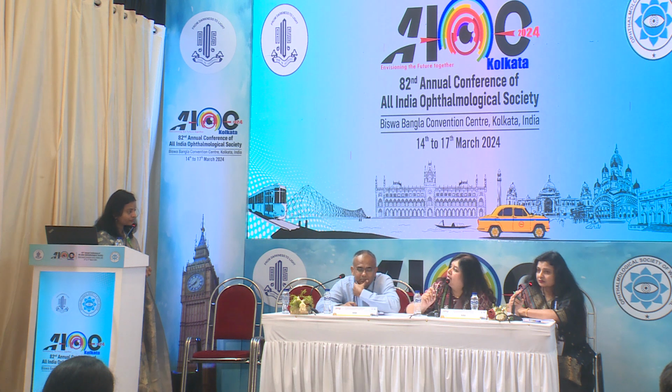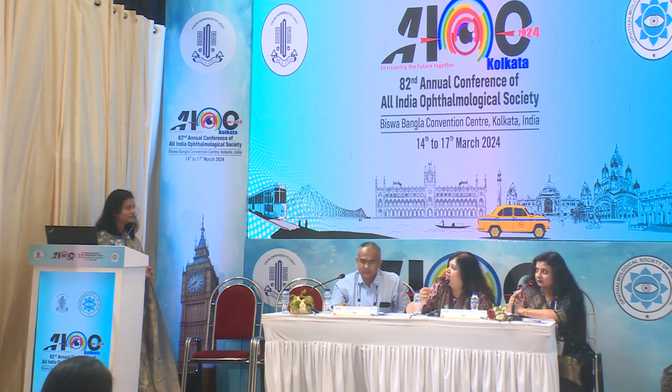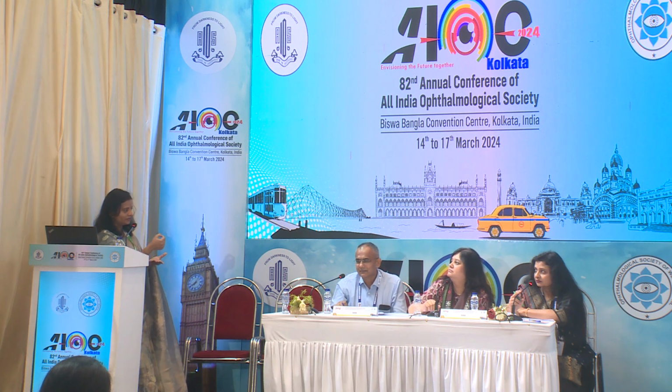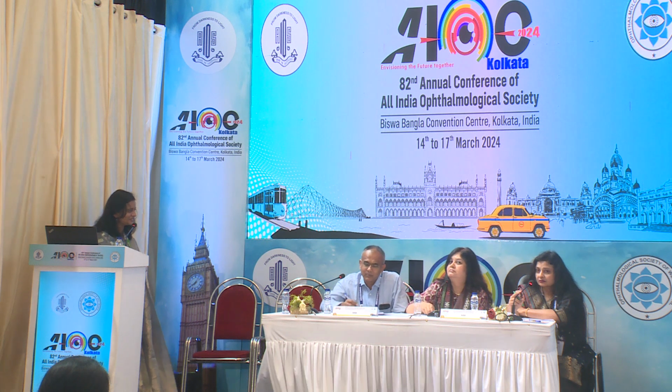Can it not be like an attachment to the microscope? Some would come with the retro, but yes, if it is, then your hands are free. You know what I mean? That is true, ma'am. But unfortunately, depending on the pupil size and everything, the distance at which the endo light has to be held varies a lot. So I don't know if we can come up with anything like that. The best view the surgeon gets is once he or she holds the endo illuminator. Yes, I agree, sir. Or else the assistant holds it, though it does require a learning curve. That is the best otherwise.